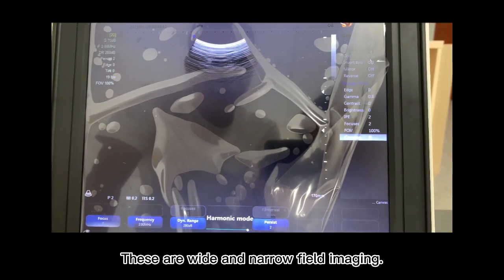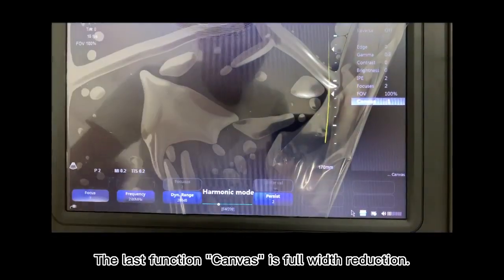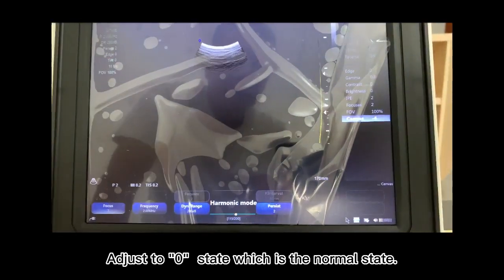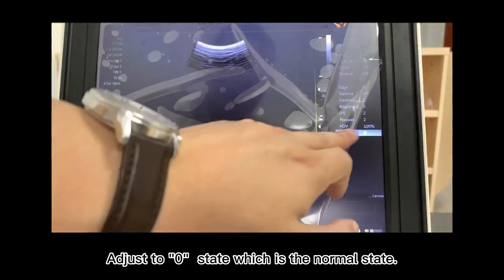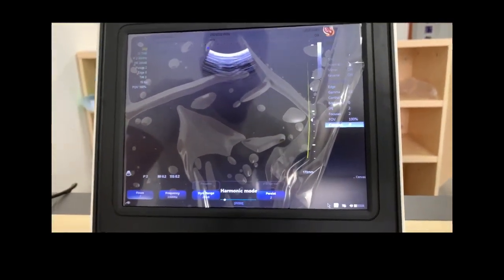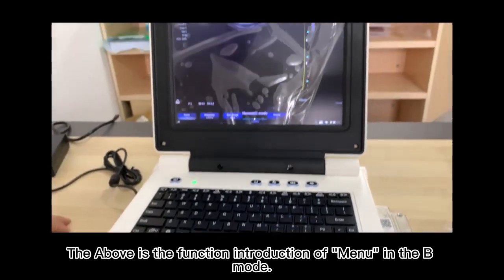These are wide and narrow field imaging. The last function, canvas, is full width reduction. Adjust to 0, which is the normal state. The above is the function introduction of the menu in the B mode.